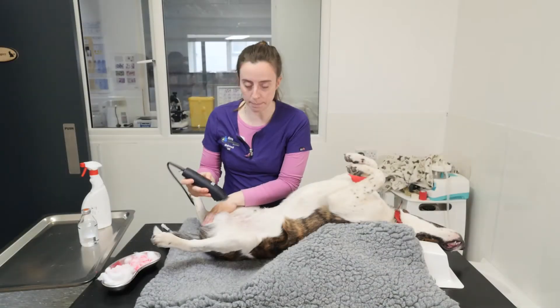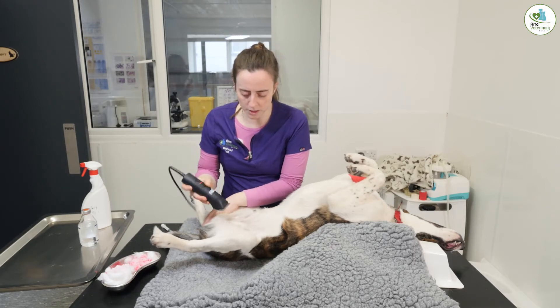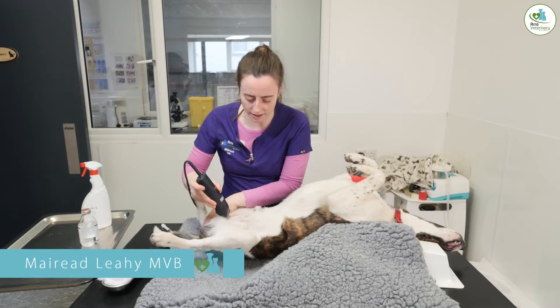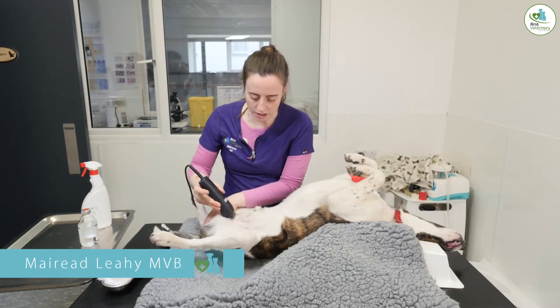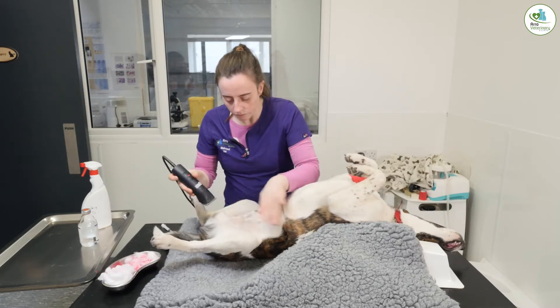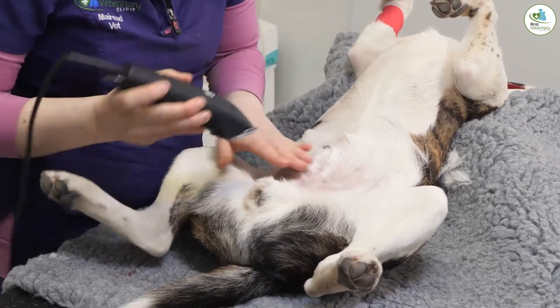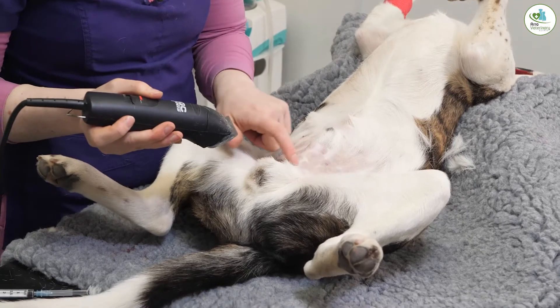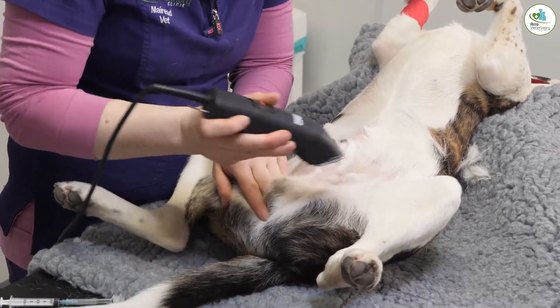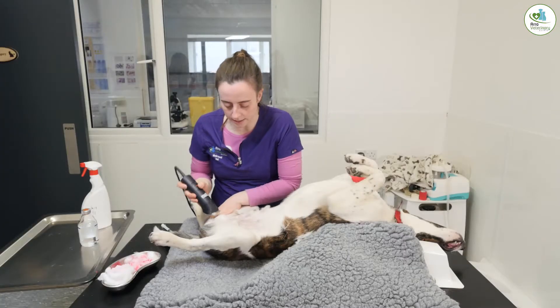After we place a cannula, the next step is to clip and prep the area, so always be really gentle with your clippers because a lot of the time these poor male dogs can get a little bit of a reaction. The neutering and castration on Covey that we're going to do is pre-scrotal, so our incision will be in front of the testicles. We're going to shave the testicles a tiny bit as well because we're going to do our local anaesthetics now too.